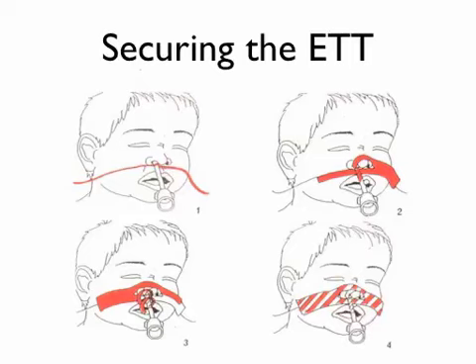Then you take the second trouser leg and, starting from the opposite side, so in this case starting from the patient's right side, rather than the moustache, the top trouser leg runs over the top of the nose and down the other cheek, and then the lower trouser leg on the second side wraps directly around the endotracheal tube as well. And then you get the third piece of tape that just has a little slit in the middle. This is in the fourth picture there, and that goes over the endotracheal tube connector. You'll just have to disconnect for a moment while you put that over, and then that sticks over all the loose ends of the other bits of tape there.